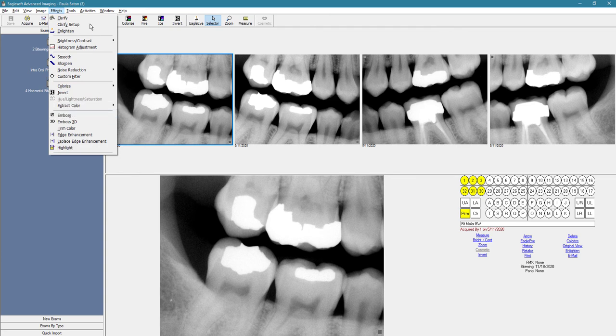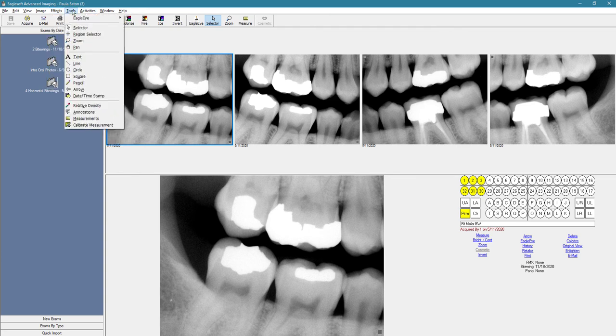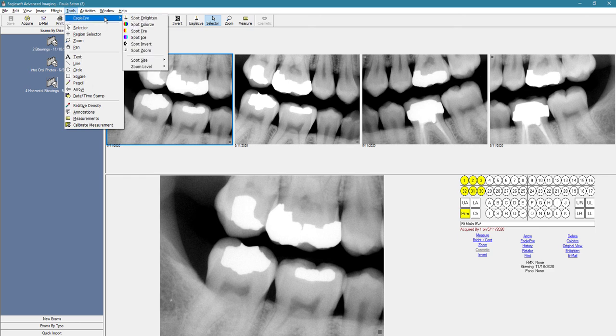Under tools, you have your eagle eye. You also have your measurements tool.